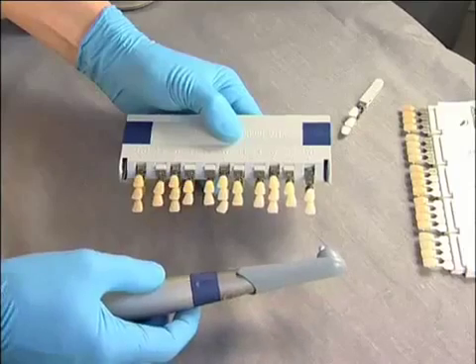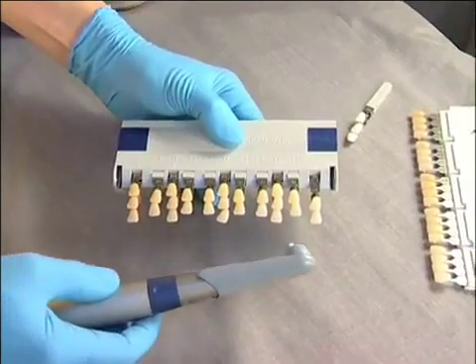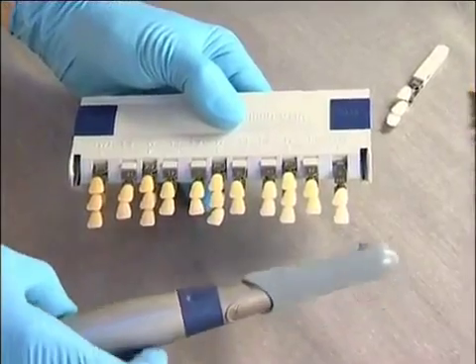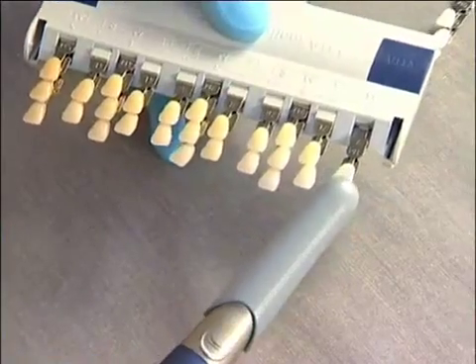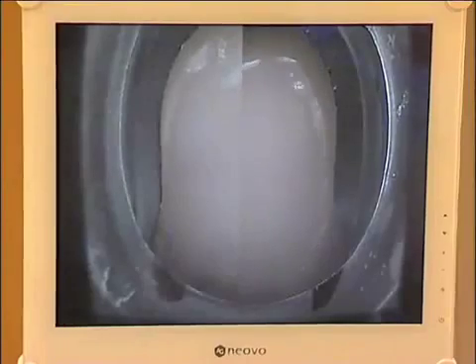Here is a color chart working with a priority of luminosity, then of saturation, and lastly of tint. For this selection function, the camera is placed on the Sopro Shade 2 position. Let us first choose the luminosity in the 5 groups offered by the color chart.